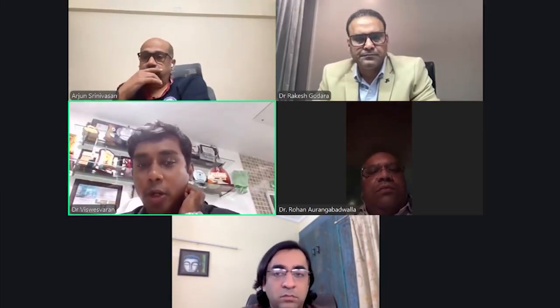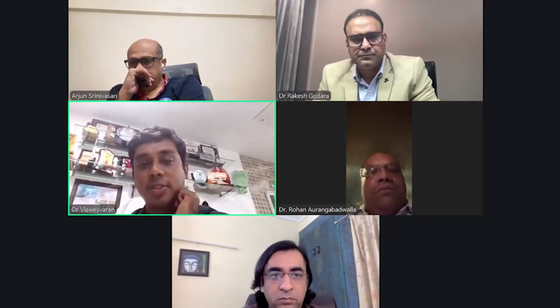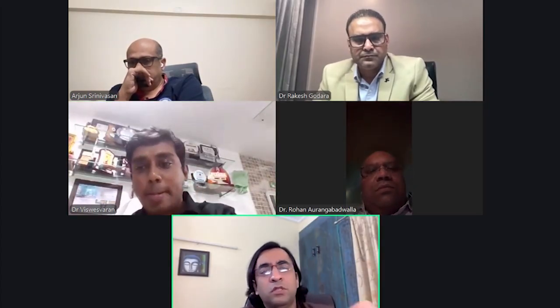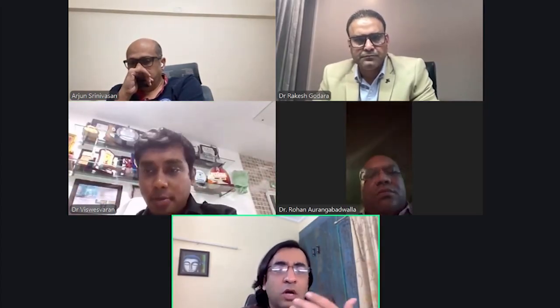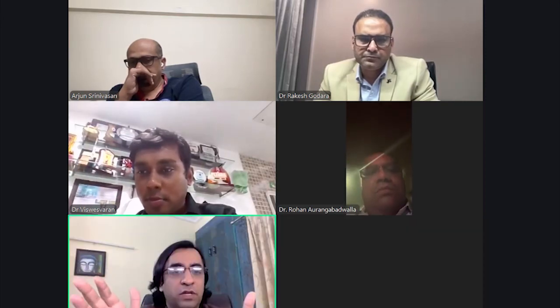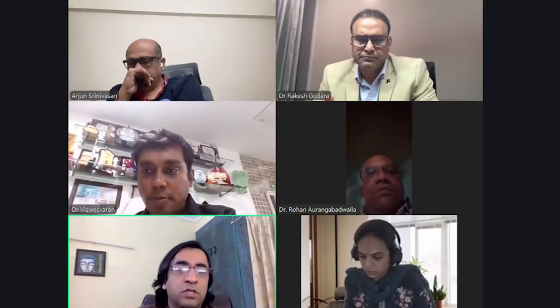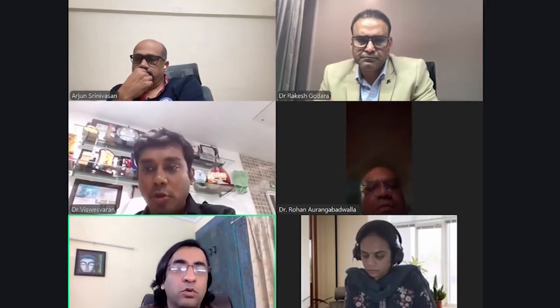And Dr. Arup from Howrah, this is to Dr. Saurav. Why are silicon stents more prone to migration than metallic stents? I think there is no radial force in the silicon stent, and the outer surface of the silicon stent is smooth. Sometimes there is a size mismatch: you have dilated the airway to a significant size, but you have put in a silicon stent which is small in size. These things make the silicon stent more prone to migration.